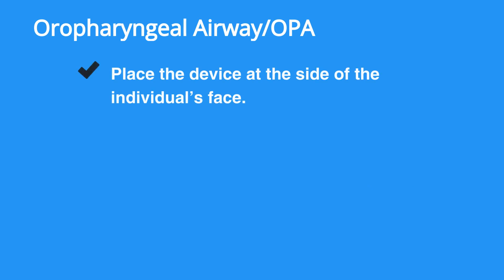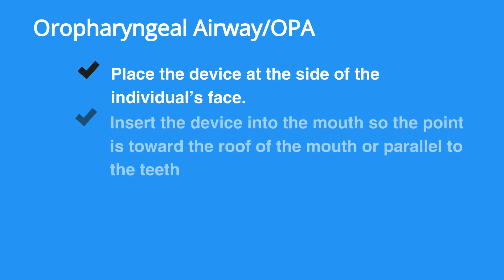Place the device at the side of the individual's face. Make sure to choose a device that extends from the corner of the mouth to the earlobe. Insert the device into the mouth so the point is toward the roof of the mouth or parallel to the teeth.